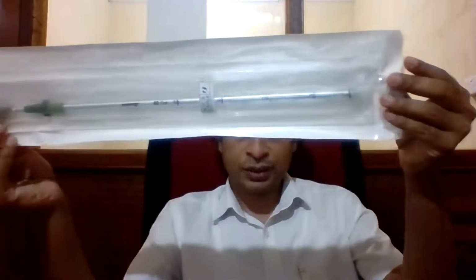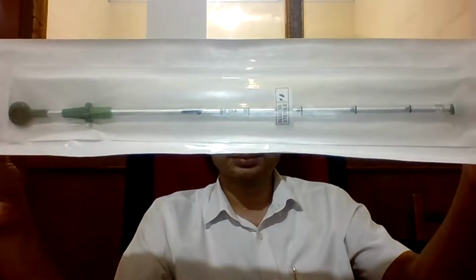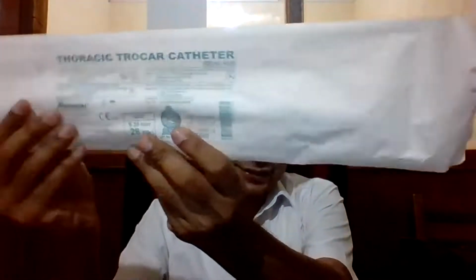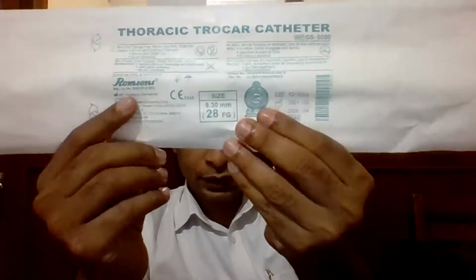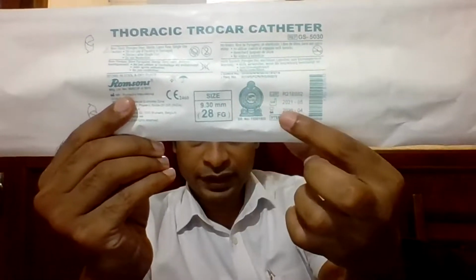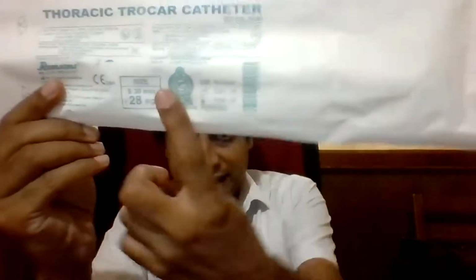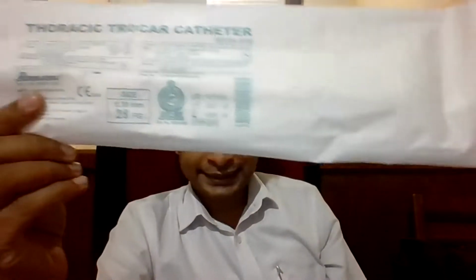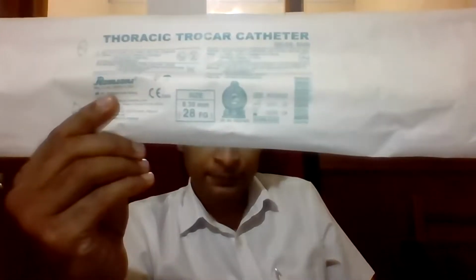What you can see here is a sterile pack that contains an intercostal tube. So you have to work out the size of these tubes when they come, and the details of the tube will be on the other side, right? The date of expiry will be over here. The date of manufacture and the date of expiry will be here. And here you will see the size of the tube. It says 28 FG. Does anyone know what FG means?